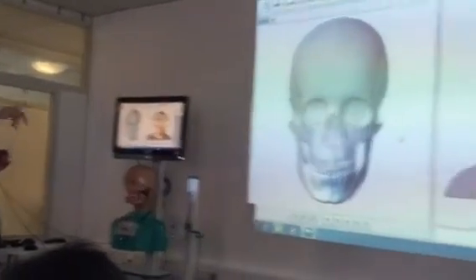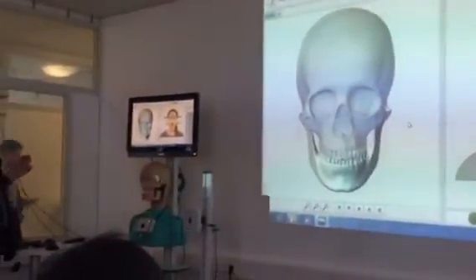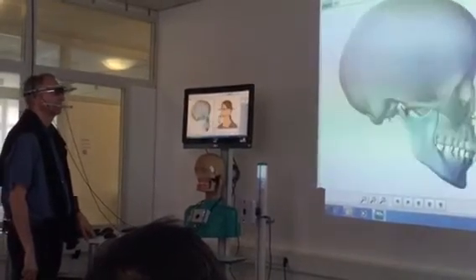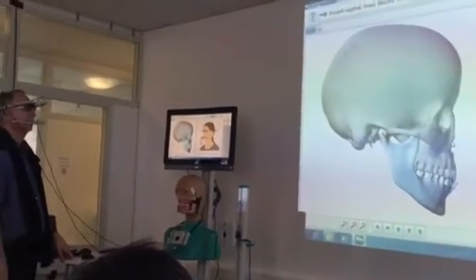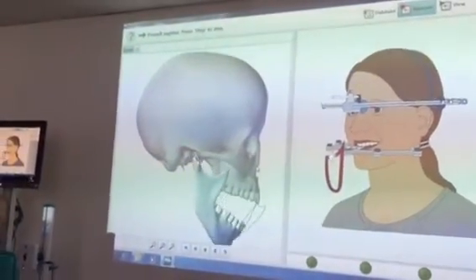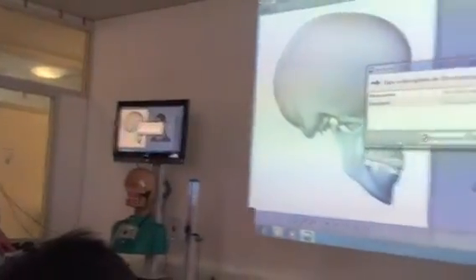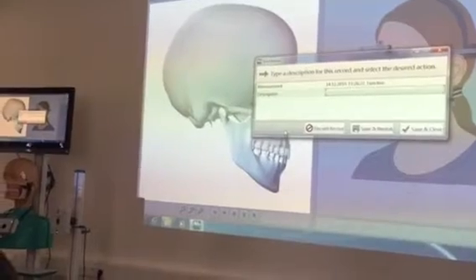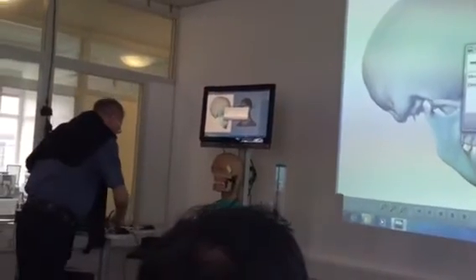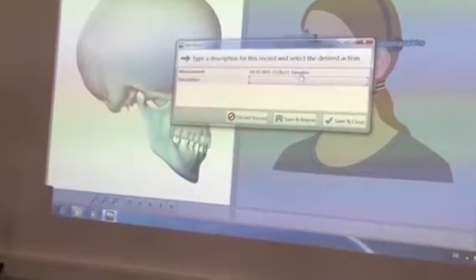This is a so-called Posselt diagram. You make the maximum movement that you can do. Same in the sagittal plane. So that's all finished. So, save and close. You can give it your own name if you want.